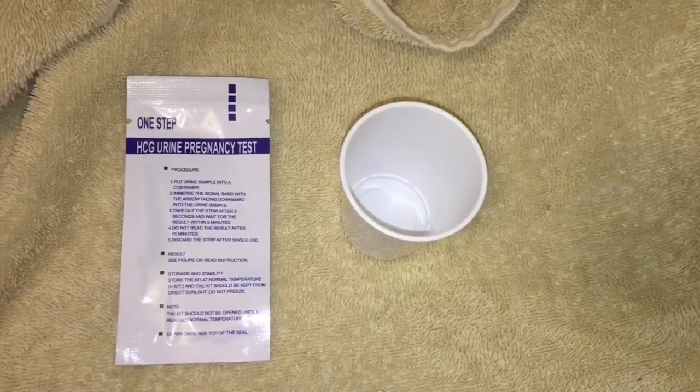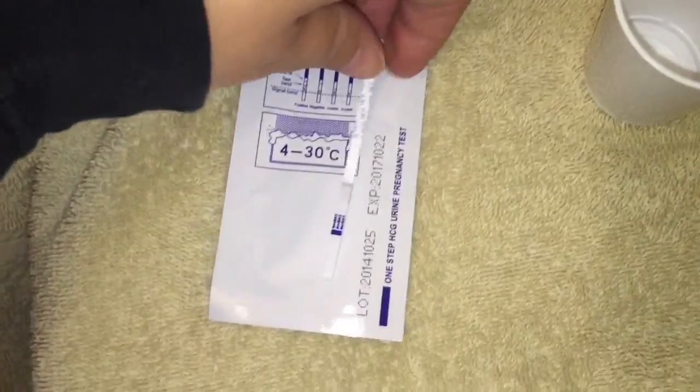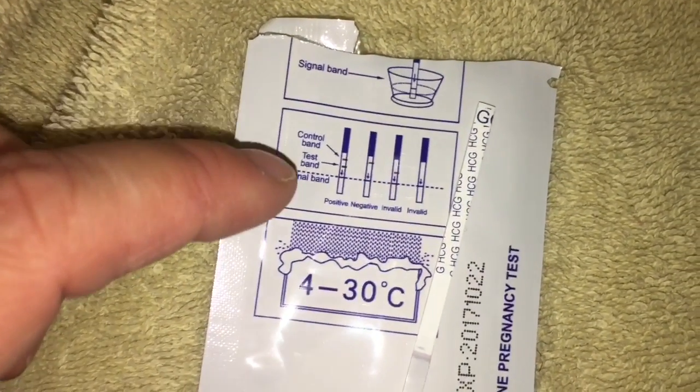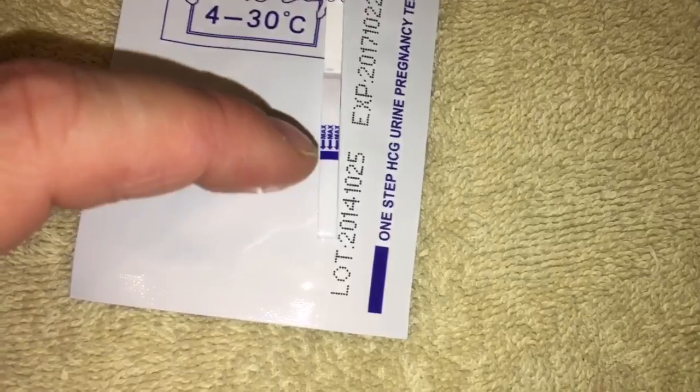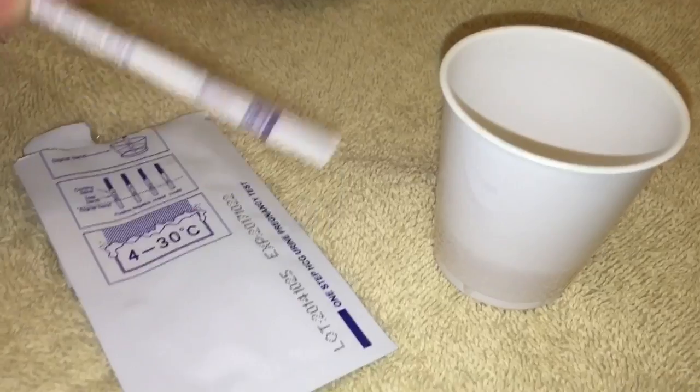So I'm going to show you how to take the test. This is what the test looks like, and I use this plastic cup here and then I put the test in. You can see on the back there is a control line which is up higher on the test, and the test band is first. This is where you put it in — up to this line right here that says 'max.' Two lines means pregnant, one line means you're not pregnant.